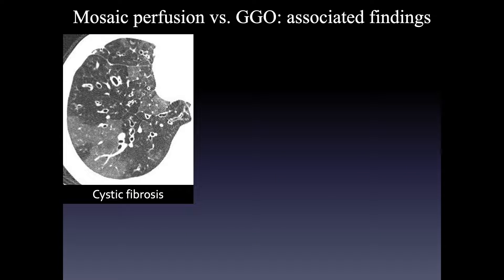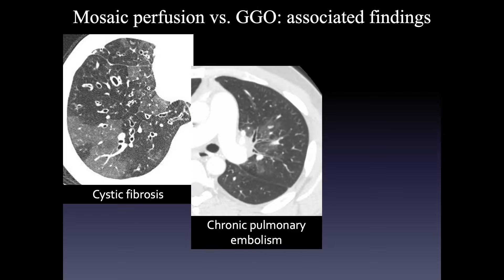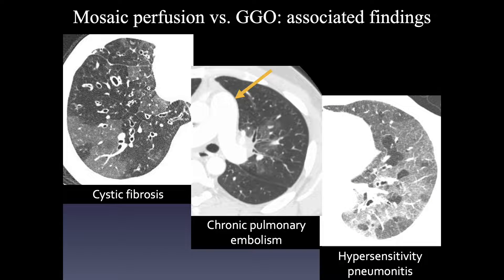Associated findings can be really helpful in predicting mosaic perfusion. In this patient with cystic fibrosis, airways inflammation and bronchiectasis are predominantly located in the lucent lung regions, suggesting the lucent lung is abnormal. Similarly, in pulmonary vascular diseases — this patient presented with pulmonary hypertension and an enlarged pulmonary artery — the heterogeneous lung attenuation represents mosaic perfusion as the abnormal lung. Mosaic perfusion can be seen with a wide variety of different findings, and those other findings may help narrow the differential diagnosis.